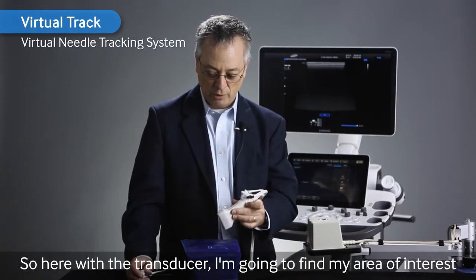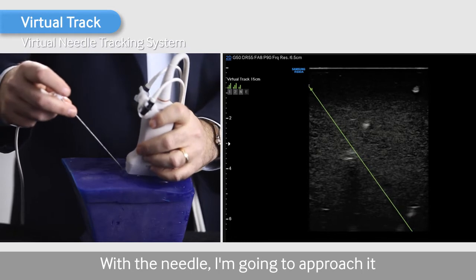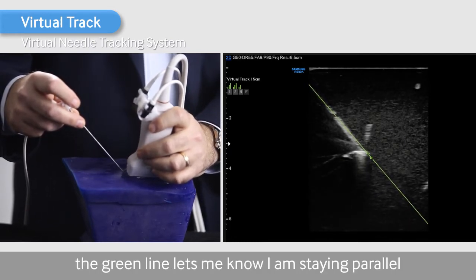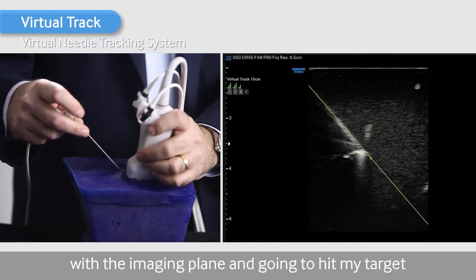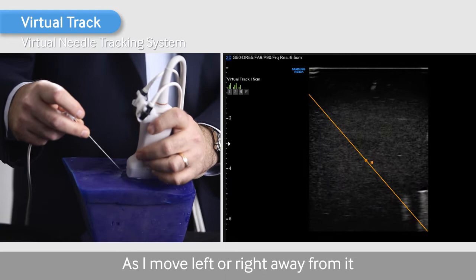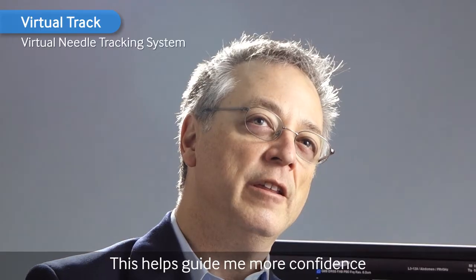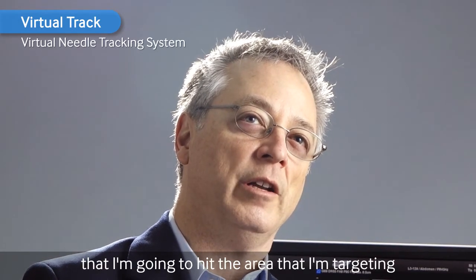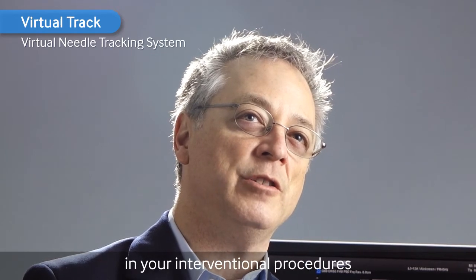So here with the transducer, I'm going to find my area of interest. With the needle, I'm going to approach it. As you see on the monitor, the green line lets me know that I'm staying parallel within the imaging plane and going to hit my target. As I move left or right away from it, you'll see this line may change color. This helps guide me with more confidence that I'm going to hit the area that I'm targeting. Again, this is another tool that can help you in your interventional procedures.